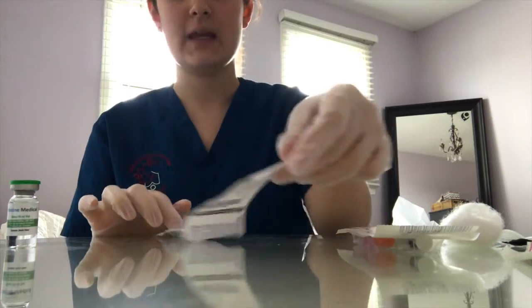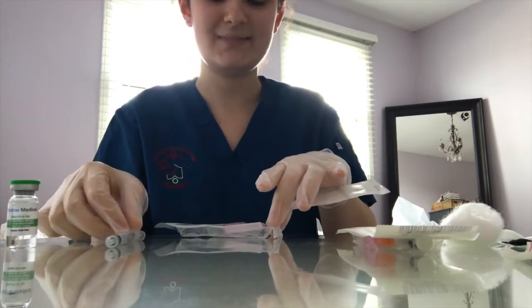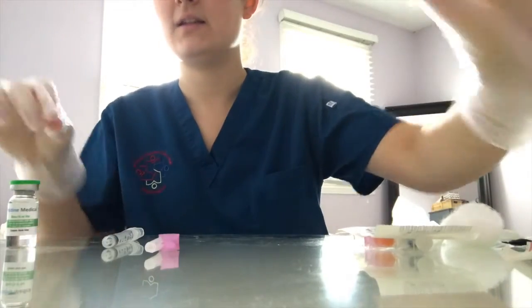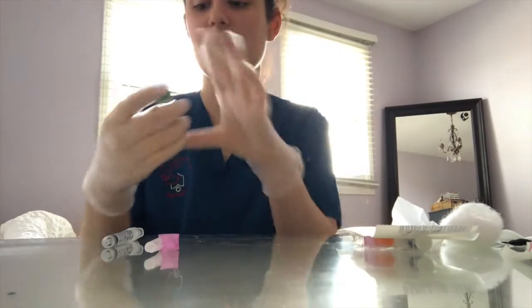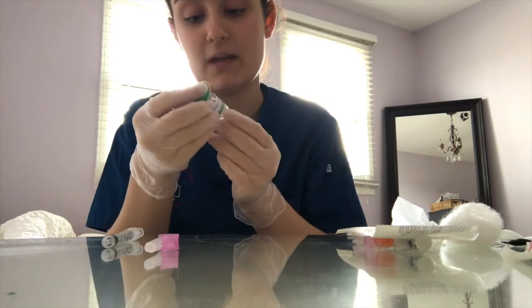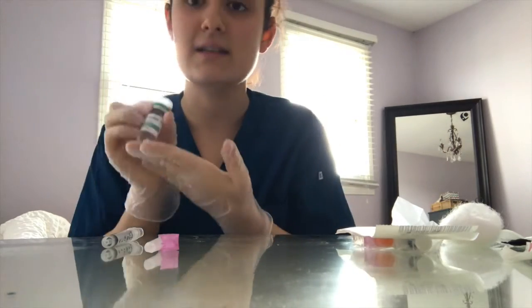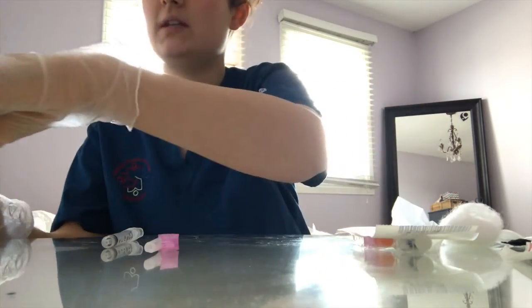So obviously you would open. I'm taking out my syringe. You can't see, but it says 3 milliliters. And this is my needle. I'm putting this in the garbage. Let's just say that this vial is the proper medication. We're giving a milliliter of Haldol intramuscularly. So let's say that this says Haldol, and I would be checking the expiry date, making sure it hasn't expired, and it hasn't. This is Haldol, hasn't expired, we're good to go. So you open. This is very hard to open, so ta-da, it's open.